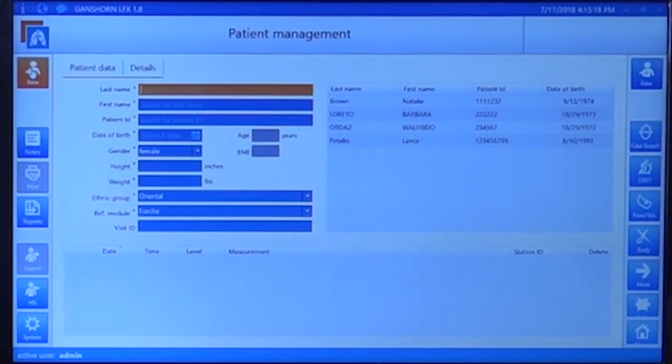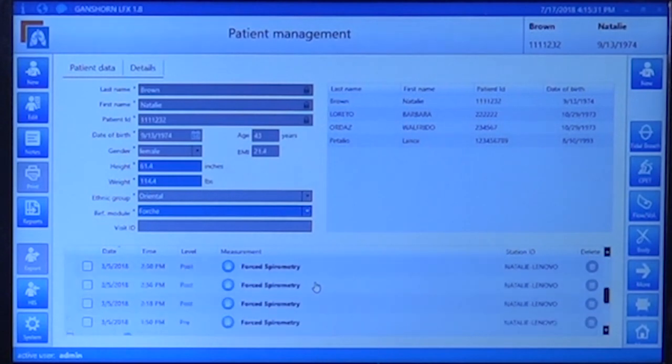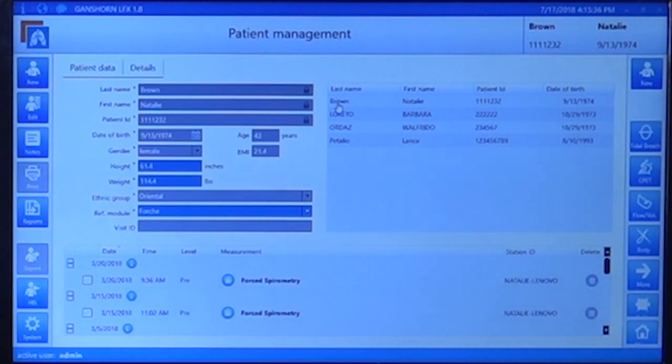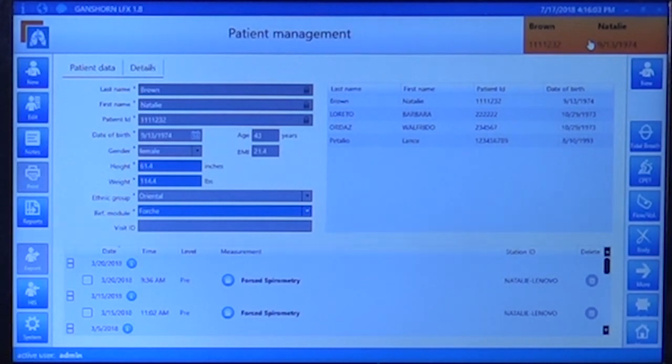When you select a patient, you will immediately see all the tests that have been performed on that patient. You can see we have forced spirometry for these patients. To add a new test, select either forced spirometry, slow spirometry, or click 'More' for slow spirometry or maximum voluntary ventilation. If we want to do a new FVC test, just click on 'Flow Volume' and the machine will automatically measure environmental conditions and open the new part of the software.